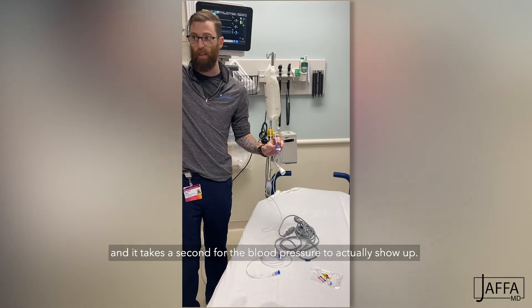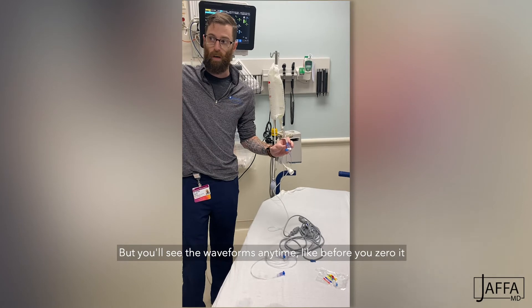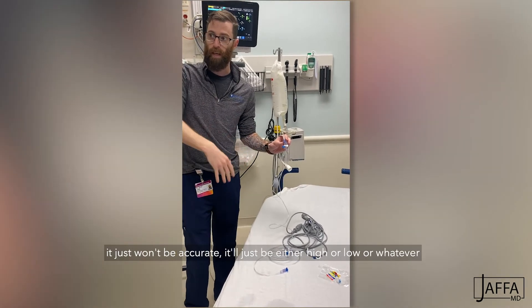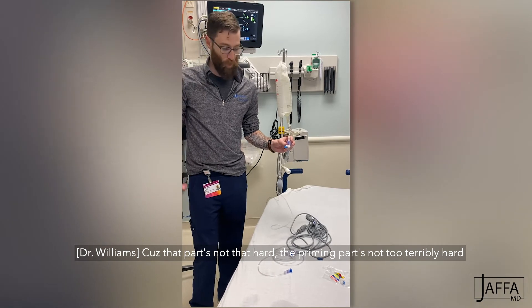It should immediately show you waveforms — it takes a second for the blood pressure to actually show up. But you'll see the waveforms before you zero it; it just won't be accurate. That priming part's not too terribly hard — it's just remembering which way to do it.